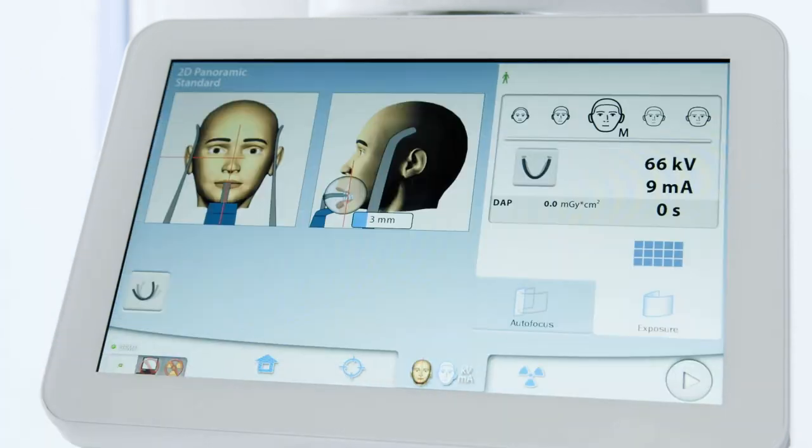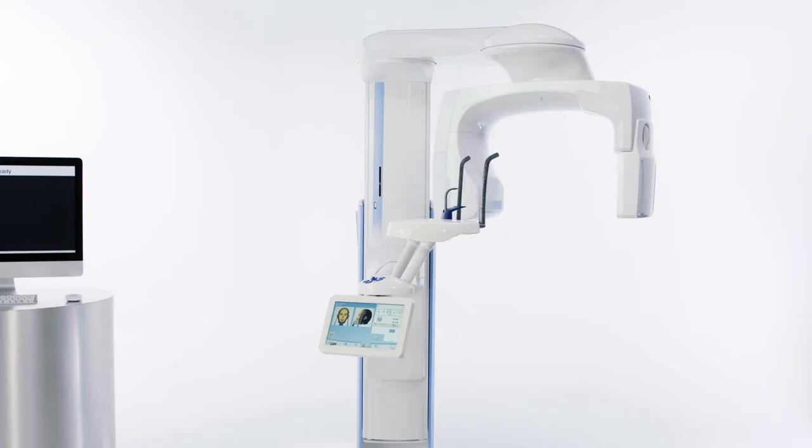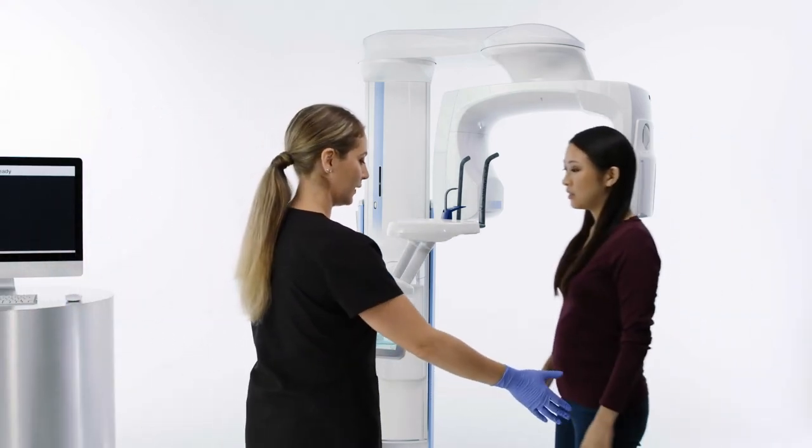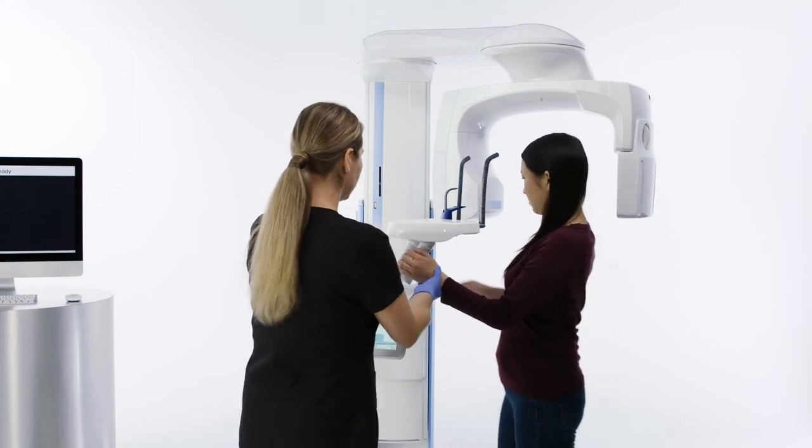Have the patient remove glasses, jewelry, all removable appliances, and hair accessories. Have the patient stand tall, hold handles, and walk close to the unit.